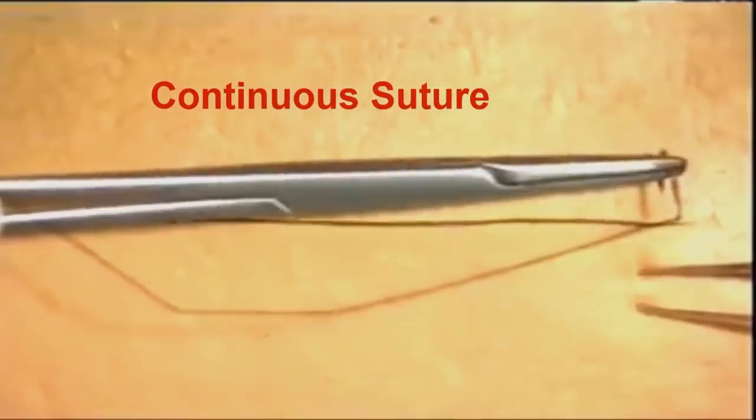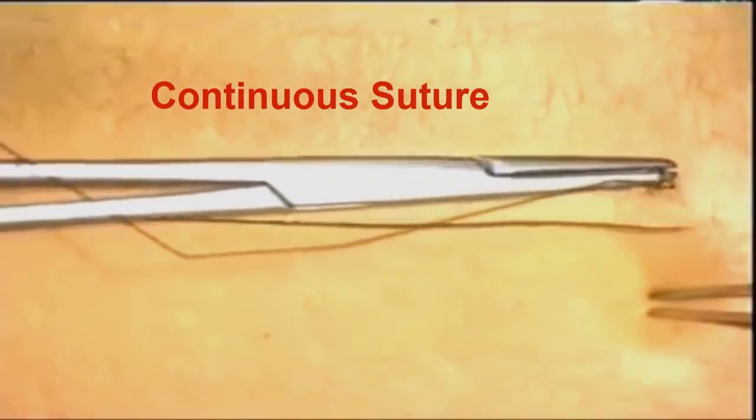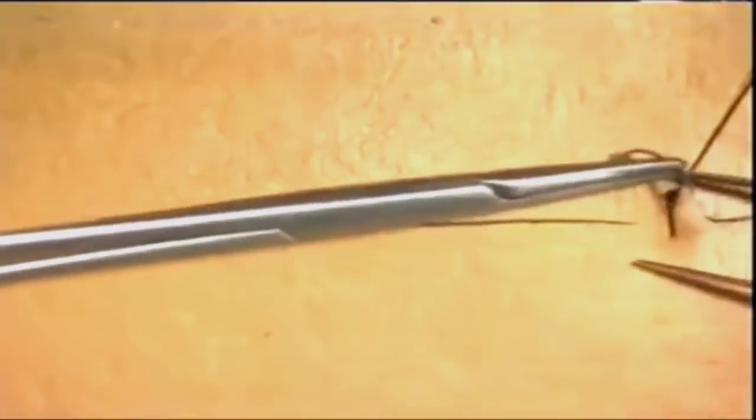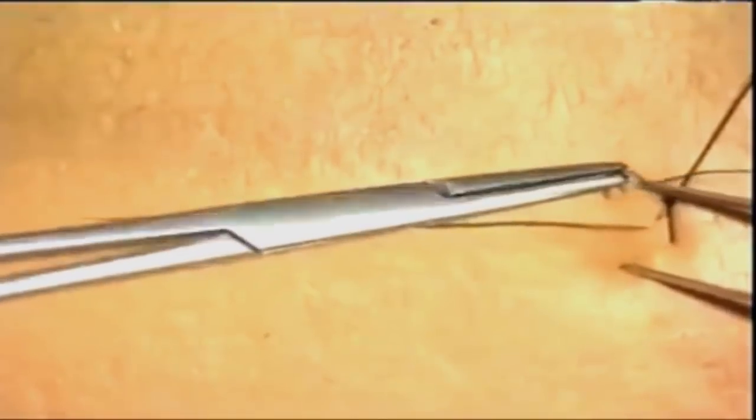We are now going to close the same incision using a continuous suture technique. Insert the first suture as before at right angles to the skin edge and ligate this using a standard reef knot. In this situation, just cut the short end and hand the long end of the suture to your assistant who will follow you during this procedure. The second suture is put in in a standard manner as before, then the suture snugged down and handed to your assistant.